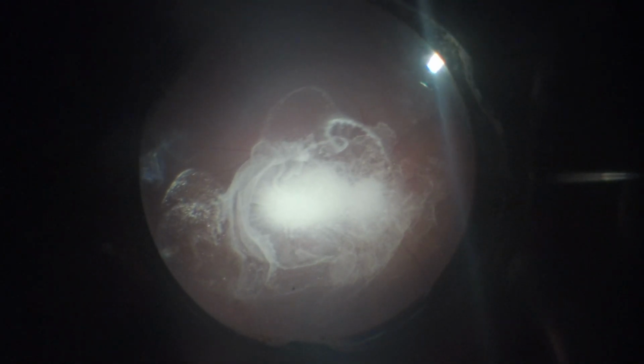After using triamcinolone, the surgeon increases the vacuum, aspirating from the nasal side of the optic disc, moving towards the periphery and upward to carefully bring the posterior hyaloid forward. Since the patient is phakic, observe how she changes the angle and carefully pulls the vitreous towards a more peripheral and superior area as she moves anteriorly.